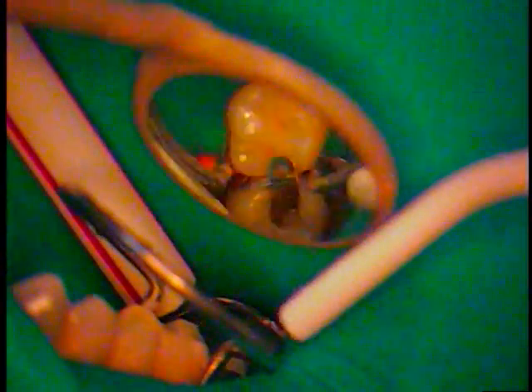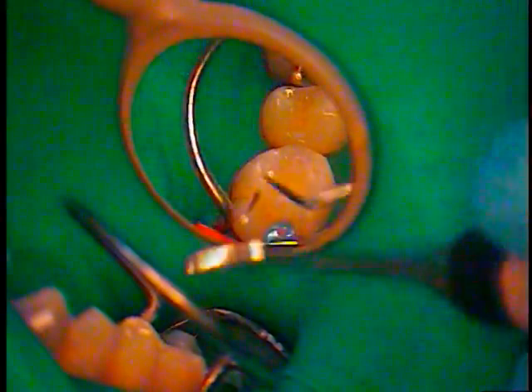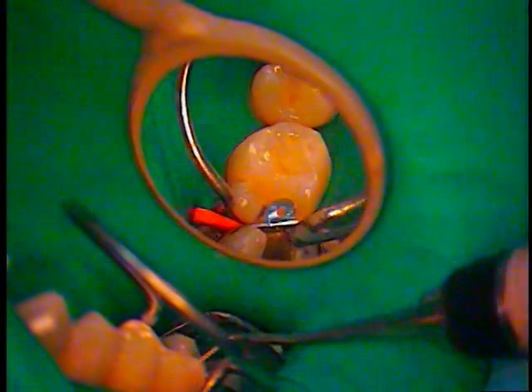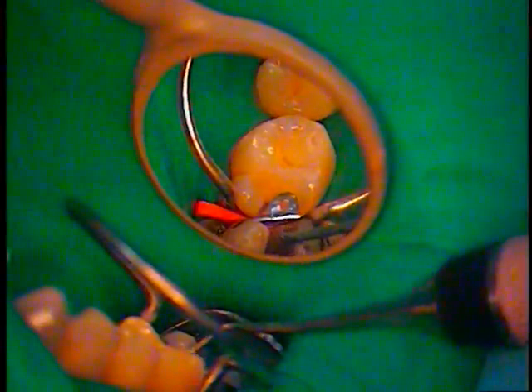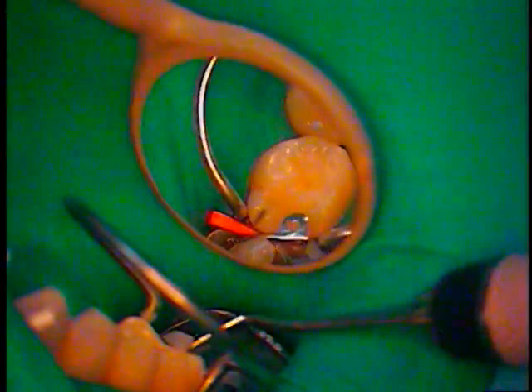So we're going to now dry that with an air syringe. That's actually no air going to the syringe, it's completely filtered, so I can push either button, I'm still going to get air coming out. Now we're going to burnish a contact, keep the air and moisture out of there from getting contaminated. Just a gentle contact, back and forth. There you go, we're good to go.